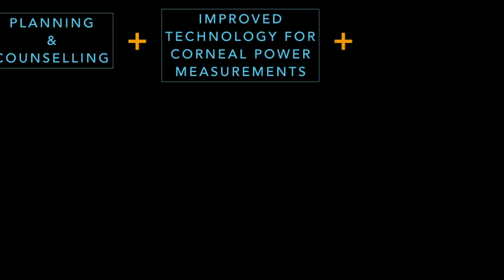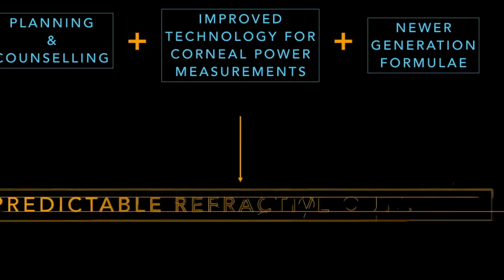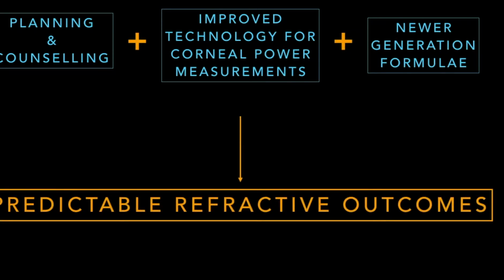To conclude, with proper planning and counseling, and with the availability of advanced technologies for corneal power measurements and newer generation formulae, visual and refractive outcomes may be significantly improved in post-LASIK eyes, and patients may achieve excellent outcomes which are no different from routine cataract surgery.